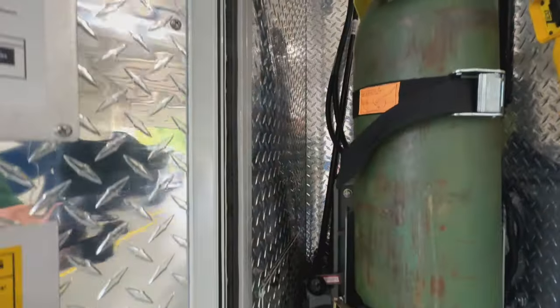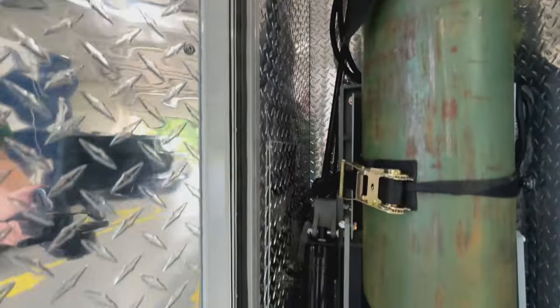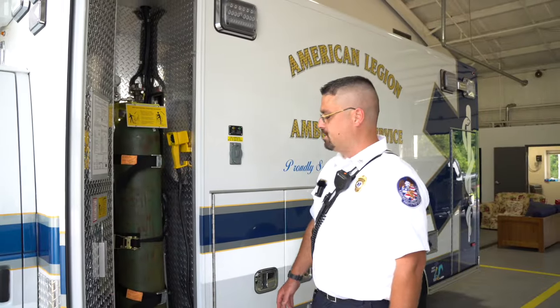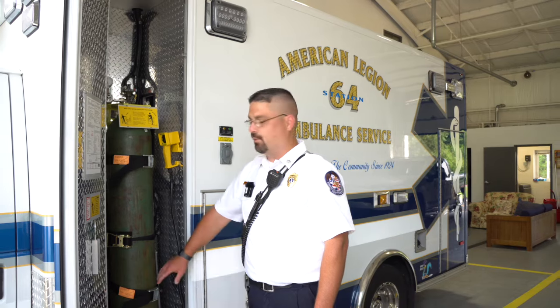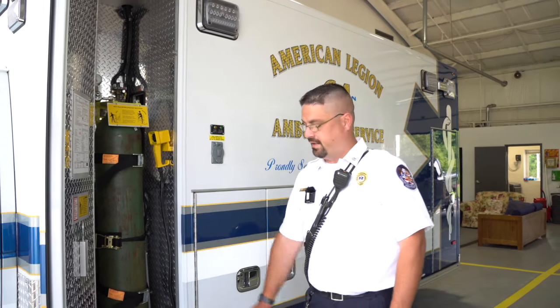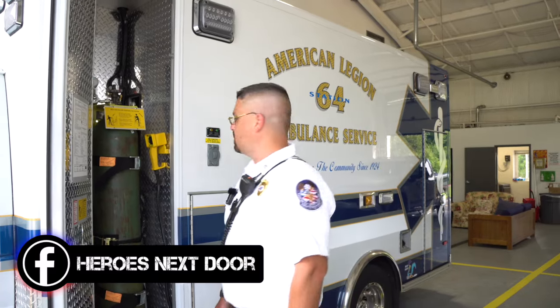I noticed you have a way to get the oxygen tank in and out of the truck. When I worked on trucks, I had to pick that thing up. We've evolved over the years — back injuries are very prone for EMS workers. So this lift system will actually bring it down out of the truck and bring it back in. Could you show me how that works? Absolutely.